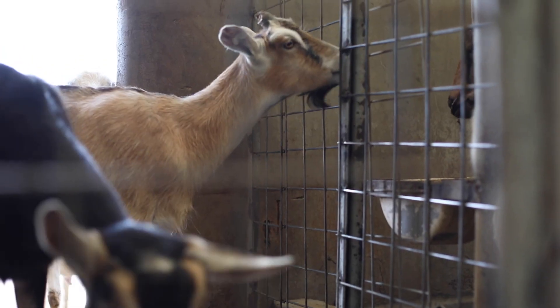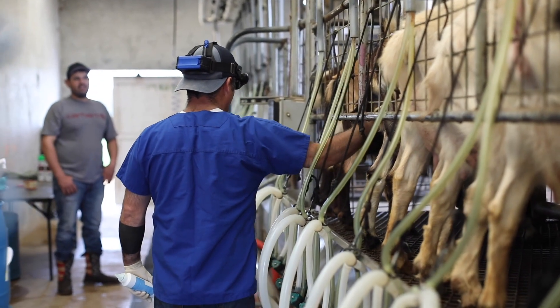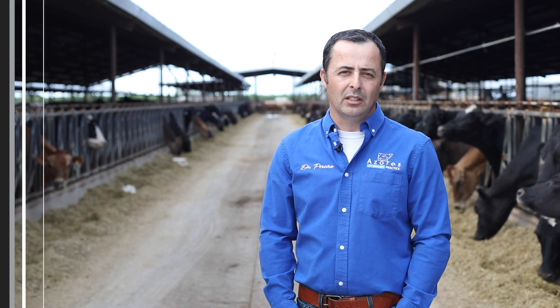On the small ruminant side of things, I have a DualScan Go. I like the fact that I use the small handheld device with my wireless goggles and we can get a lot of animals checked in a small amount of time.